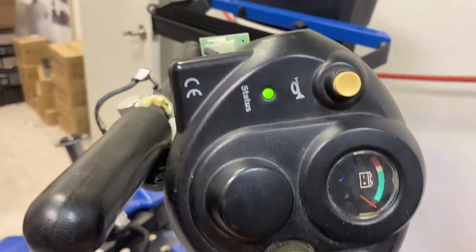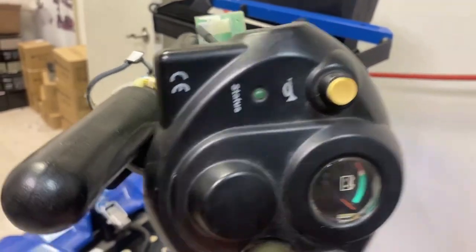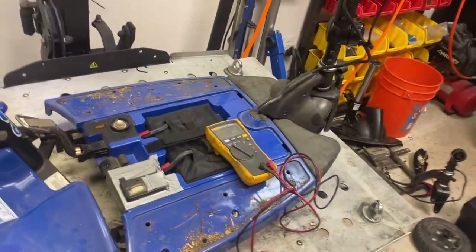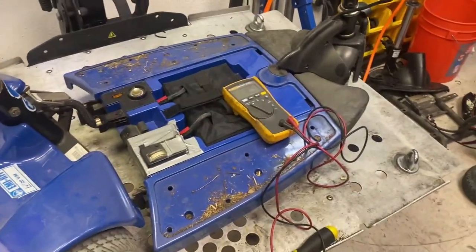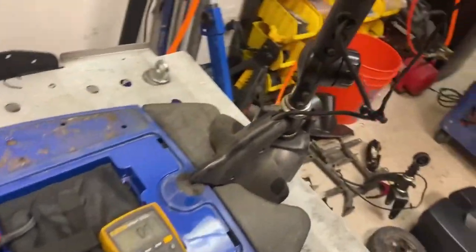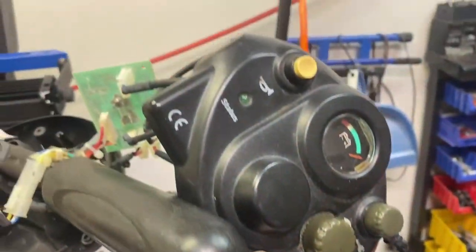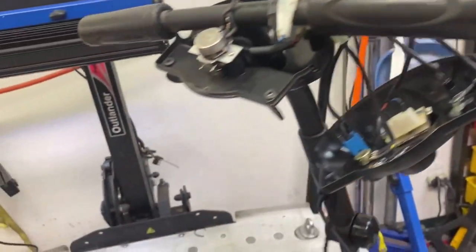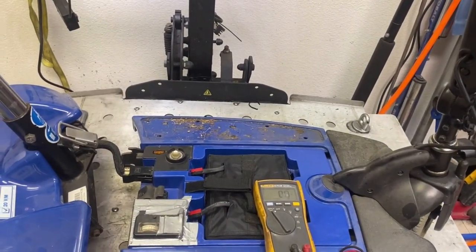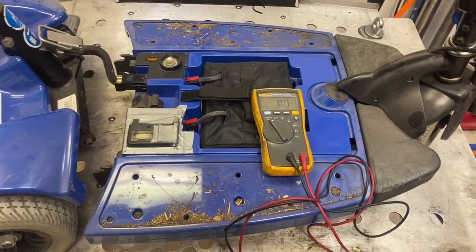Okay — two, three, four, five, six, seven, eight, nine. Nine is controller fault. So we know for a fact it's the controller that's gone out of this scooter. I've saved myself a lot of time — now I know what the scooter's actually doing with that flash code. Before, I didn't; I was guessing. So now I know exactly that it's a controller fault.